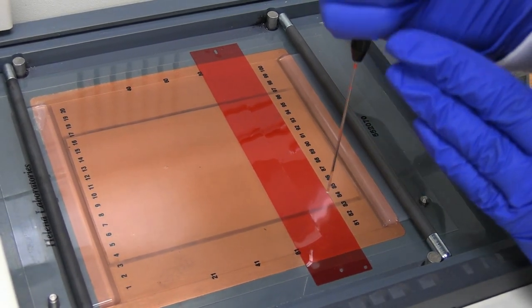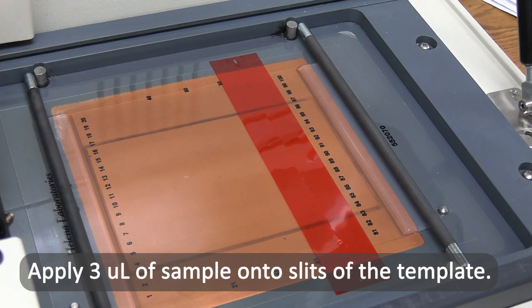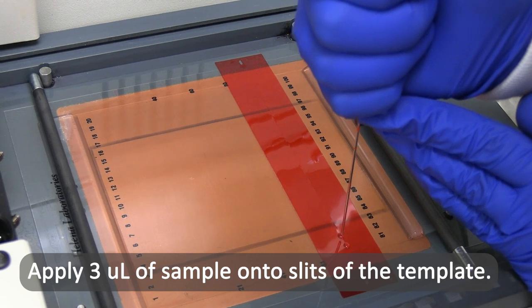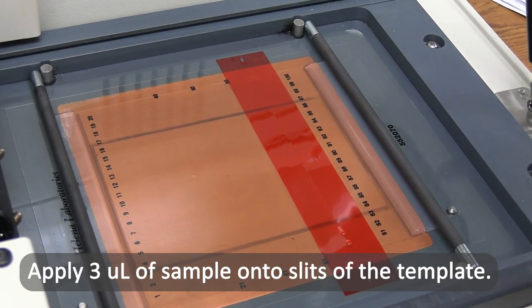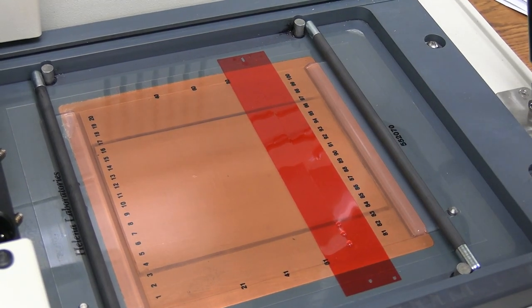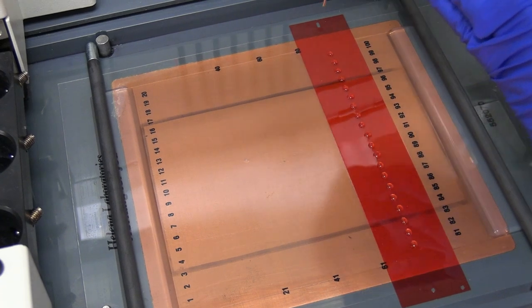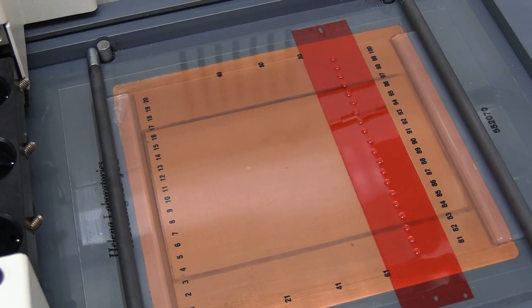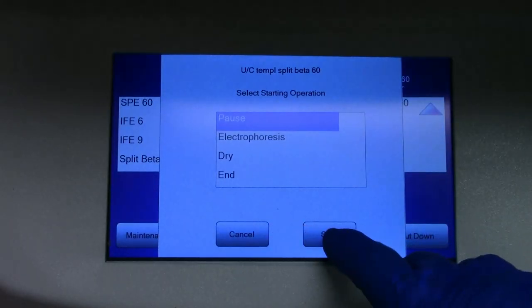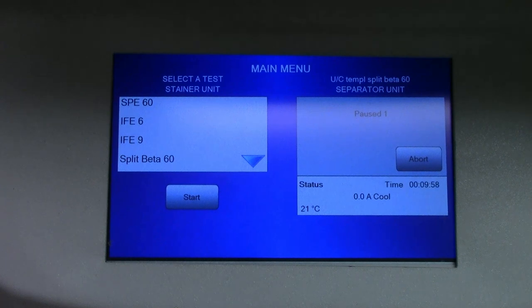Apply CSF and/or urine by placing 3 microliters of each sample onto one of the 20 available slits on the CSF urine template. Close the chamber lid and then press start again. Sample application will be timed for 10 minutes.